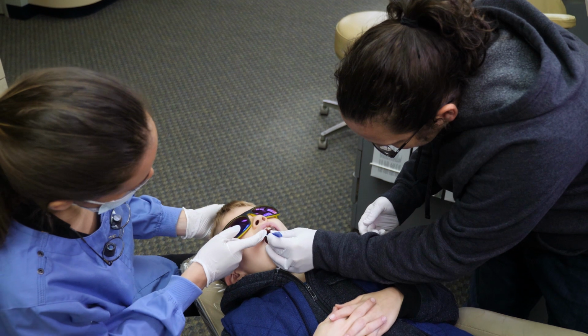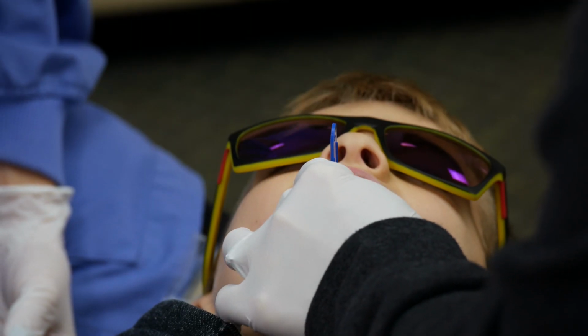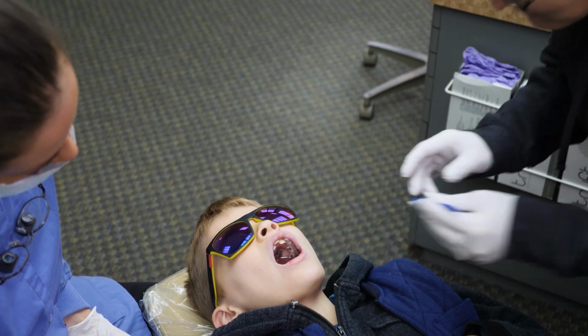Before the patient leaves the office, the parent needs to activate the expander under an assistant's supervision at least once or twice.